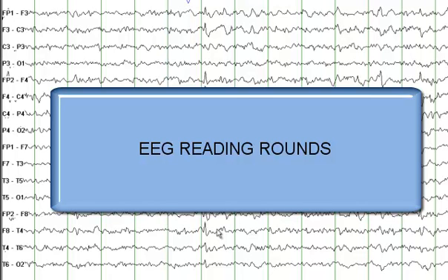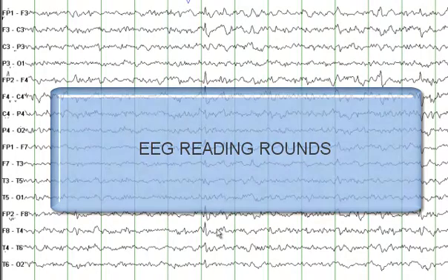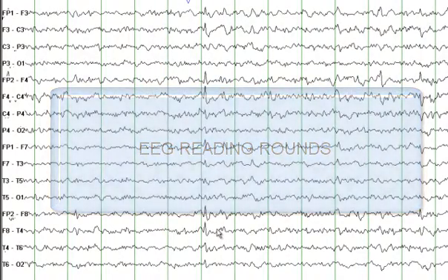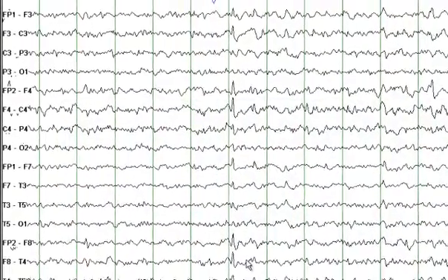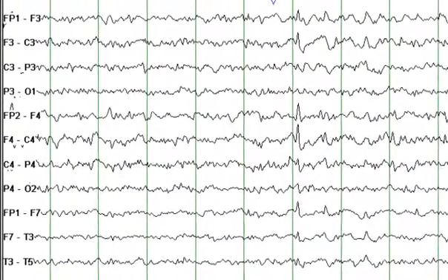Welcome to the EEG Reading Rounds. In the next few minutes, I will walk you through some of the important features on this EEG.